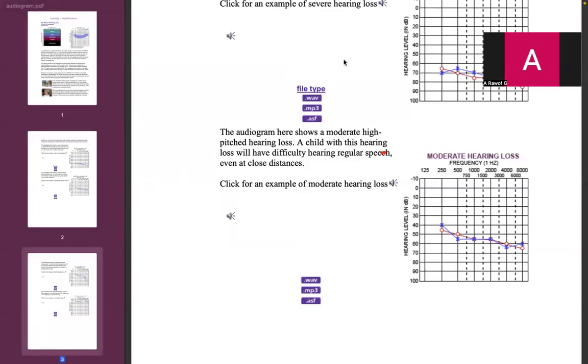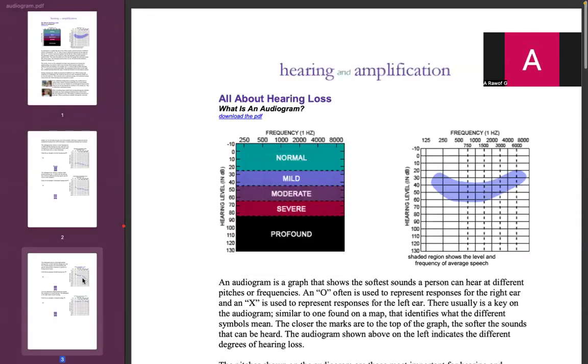Now here if we see, it is between 40 to 50, then 60, between 50 to 60, up to, it has come up to 65. We know that the moderate is between 45 to 65. So this is moderate. Moderate is between 45 to 65.